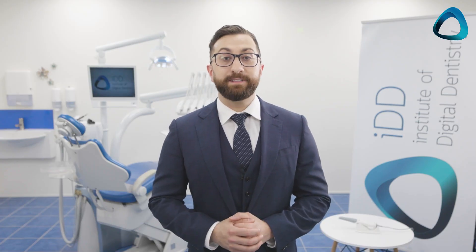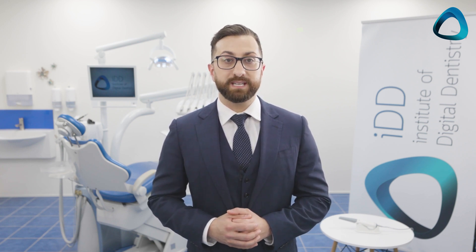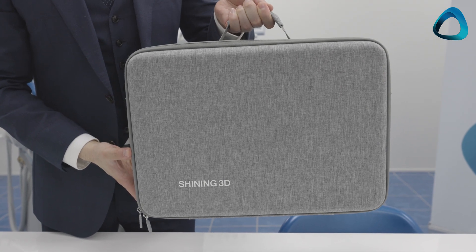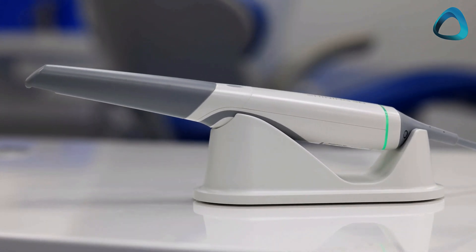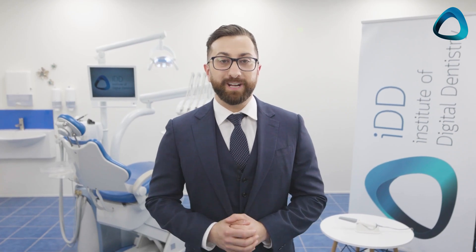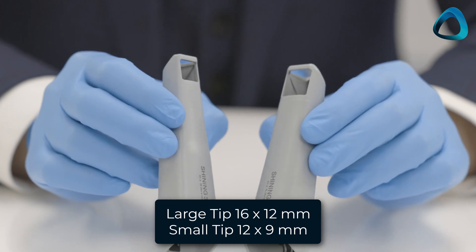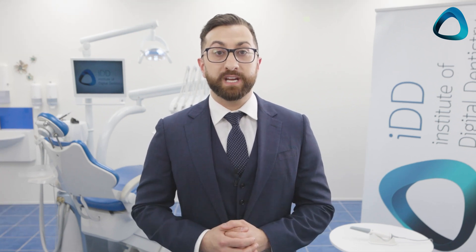But what about the scanner itself? Is it a quality product? Well, that is one thing that surprised me. I have tested many affordable scanners and found that often they feel like cheap plastic or are generally not presented well. With the Shining3D Aural Scan3, that wasn't the case. As you can see, it comes in a nice-looking travel case and the scanner generally has excellent build quality with seamless joints and solid-feeling plastic. The scanner also comes with two scanning tips — adult and child sized — with a 16x12mm field of view and a 12x9mm field of view for small mouths and hard-to-reach places. Each tip can be autoclaved up to 100 times.